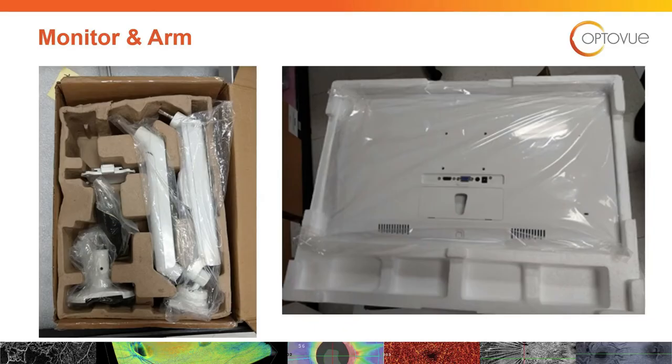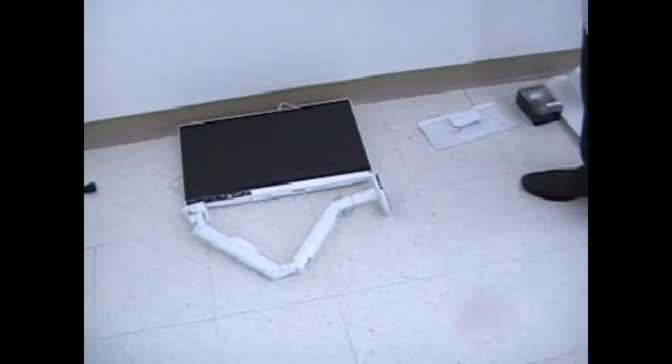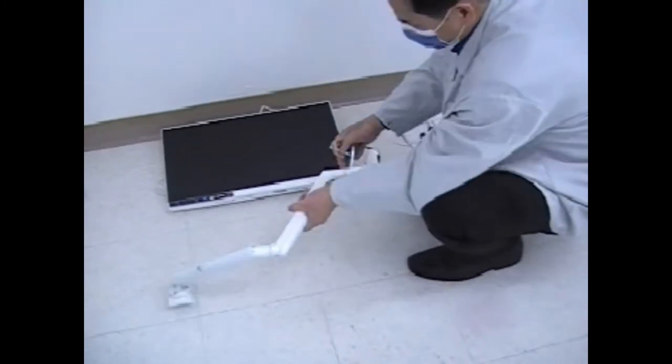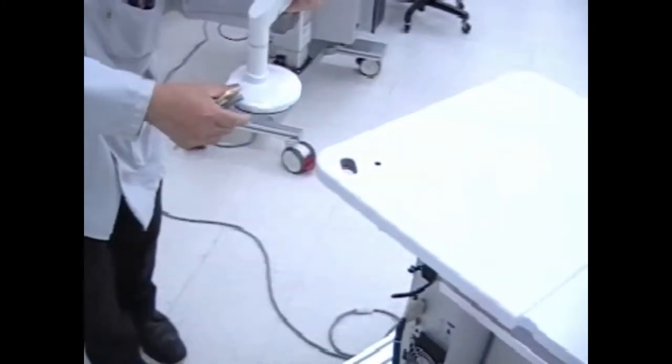Assemble the monitor arm parts. They snap together and have locking set screws. The rationale for doing the assembly now is it's easier to put it onto the table before the computer is attached.